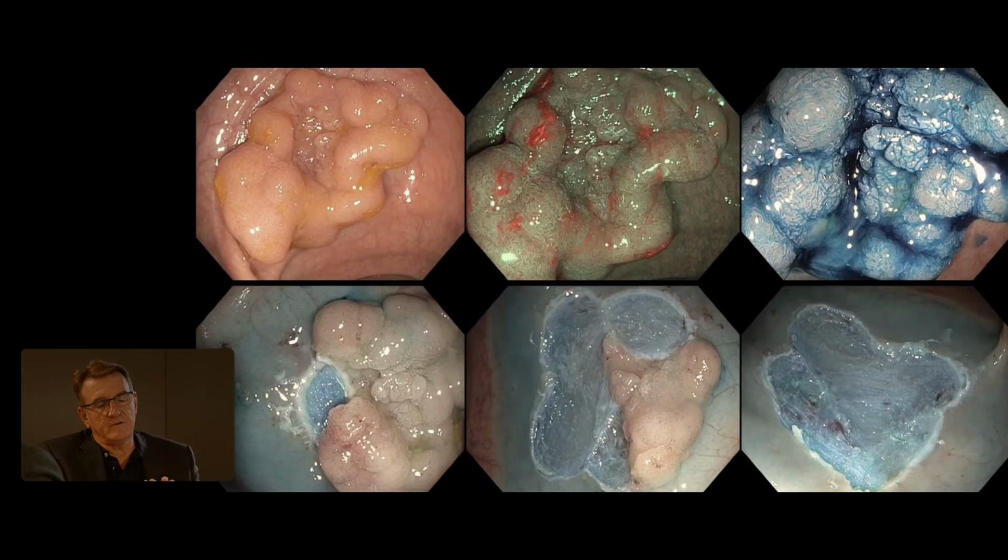But when you lift a non-granular lesion, it's more diffuse. It's like lifting something in the stomach. When you lift in the stomach, you never get that nice elevation. Everything goes up together. So that makes endoscopic resection by piecemeal EMR technique more difficult. Non-lifting was historically a tool that came into being before we were so good at imaging.